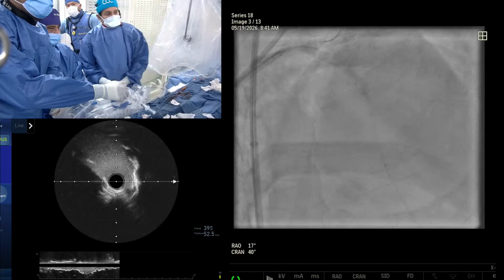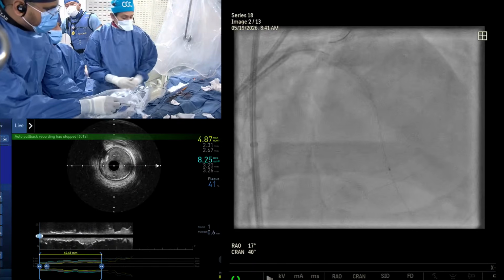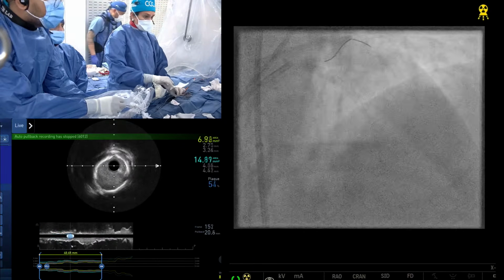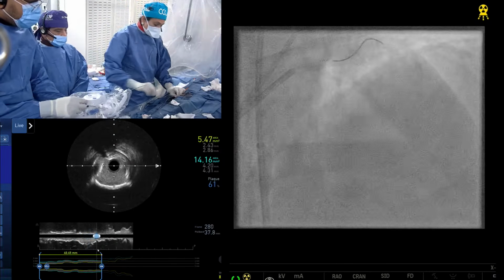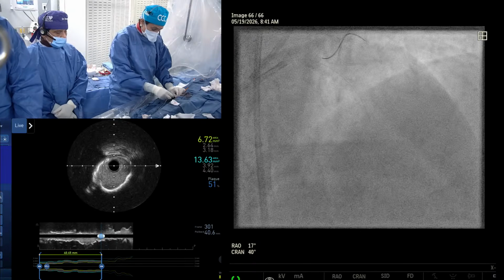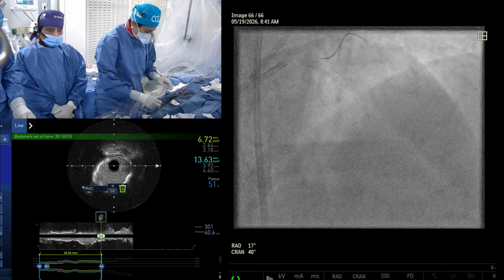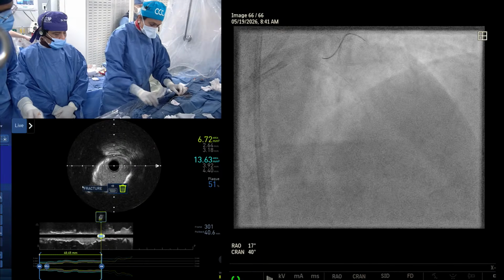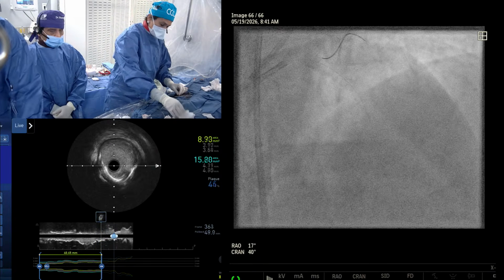That exact question has not been studied yet. We are actually doing our own trial, Nodule Shock, to understand whether you have to give the entire set, because the original teaching was that if the dog bone effect is gone, there's no need to give all the pulses. But the question is whether it is operator determined or you have to give all 120.